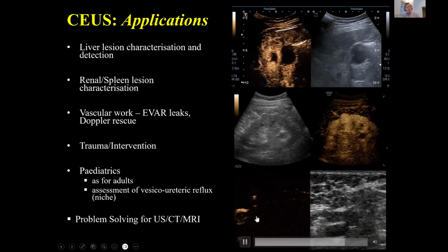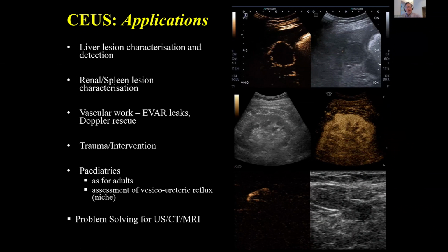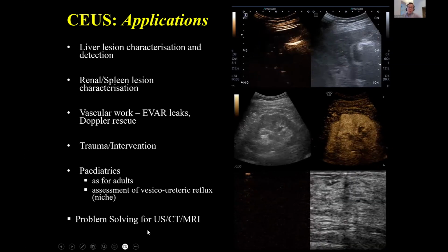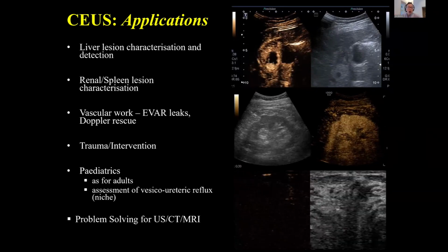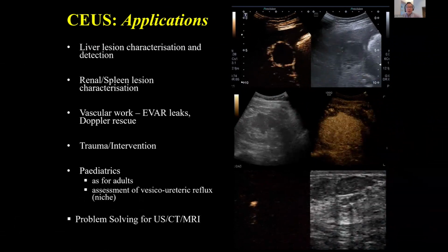So just giving you a flavor of what contrast ultrasound can be used for and how useful it can be in its whole variety of applications, but also typically in the radiology department, we will be using it to problem solve for those indeterminate lesions on ultrasound and those small lesions you can't quite properly characterize with CT and MRI.